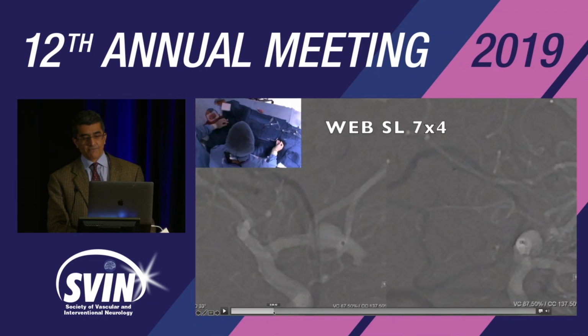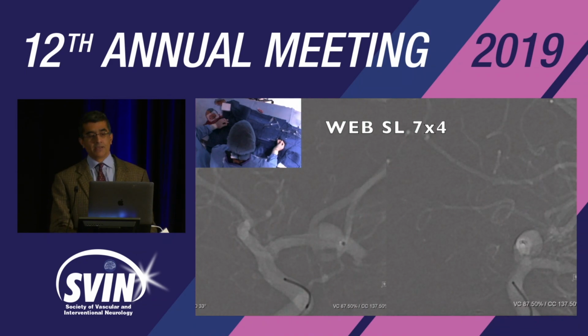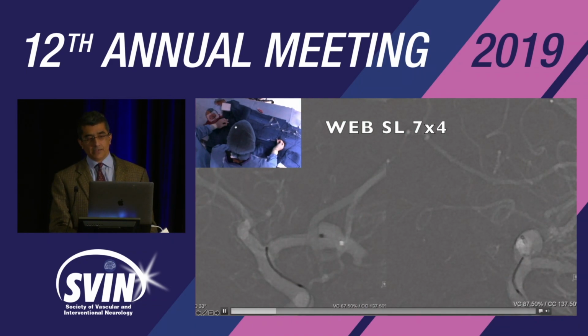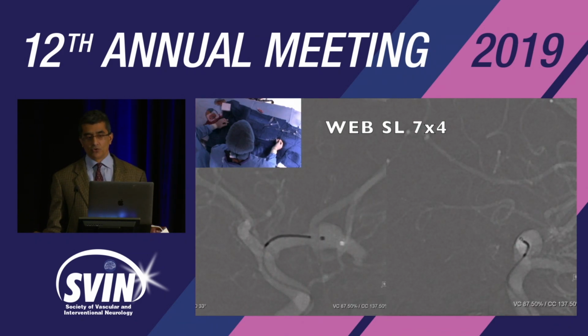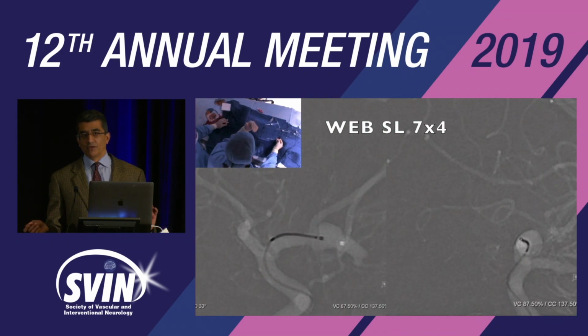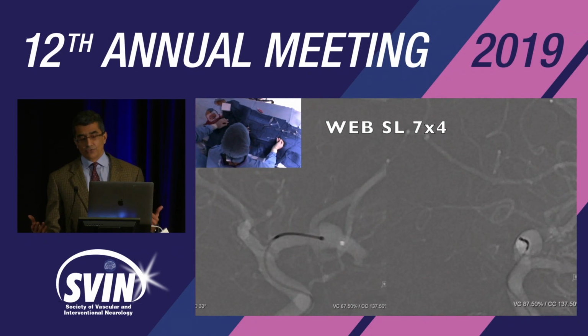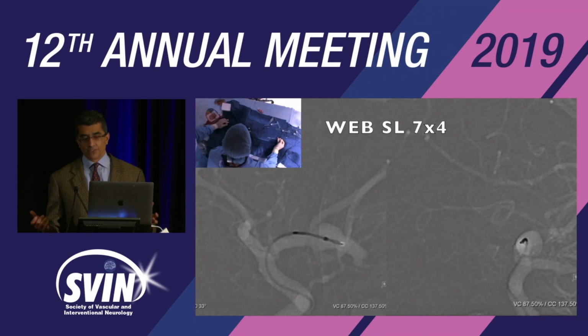As we know, the device, it's a 7x4 SL, as it comes across the siphon, will tend to pull the microcatheter back. We really have found that using both hands has been extremely helpful in controlling the device, because not only do you have to control the device, but the movement of the microcatheter. It's a fairly dynamic process, not dissimilar to deploying a flow diverter, but requires a little more coordination because we're working in a smaller space.